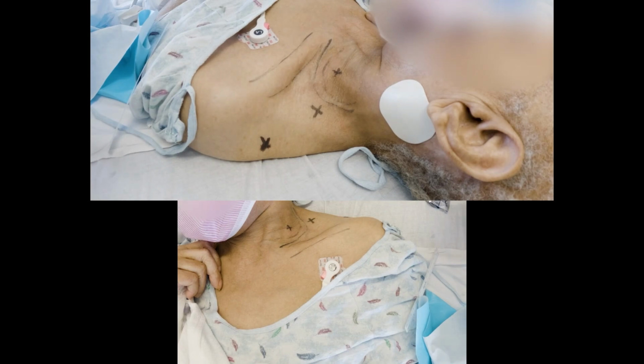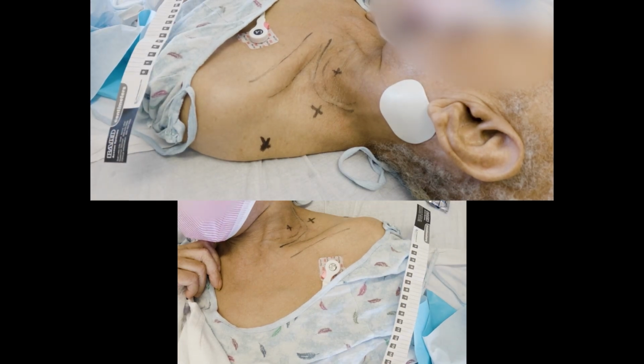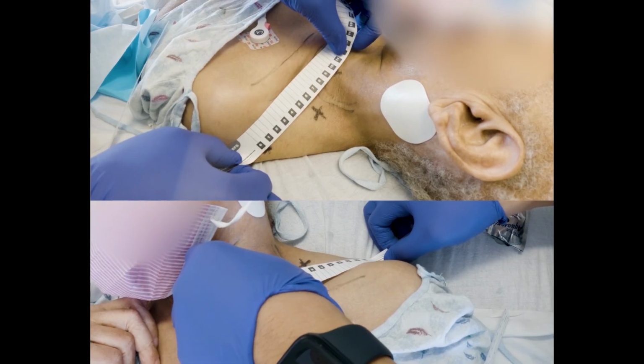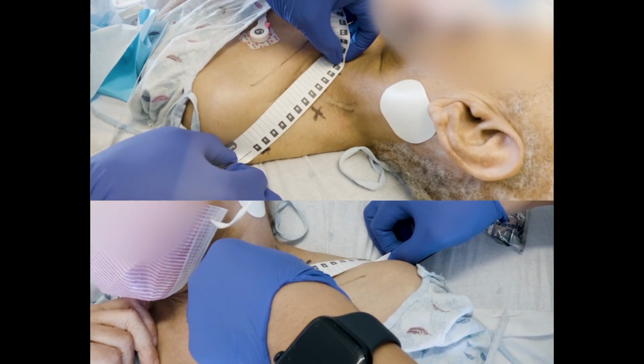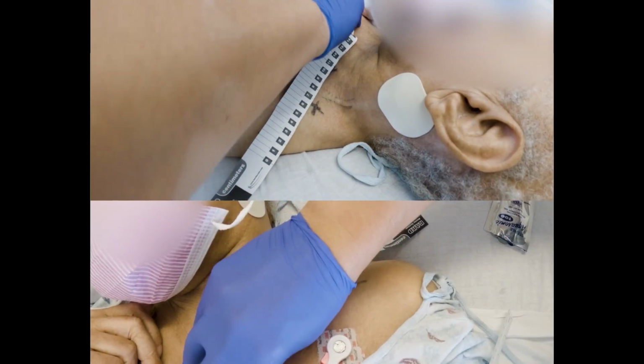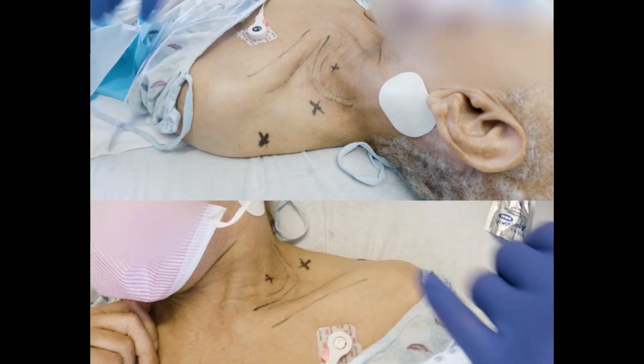So let's try that again. I like to remeasure, especially for something like this where the measurements make all the difference. Let's say from here to here, still at about 10, let's say 11 centimeters. From 11, 20, 1, 2, and 3. Let's try that again. That was a little bit different.